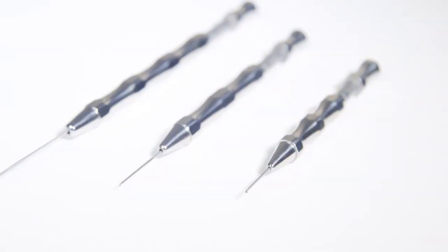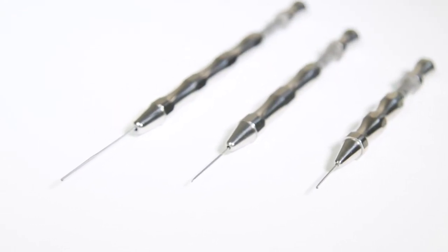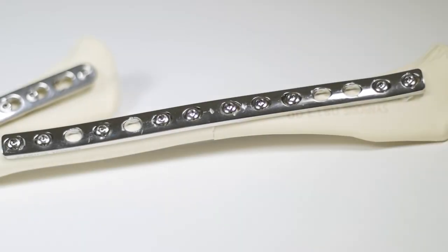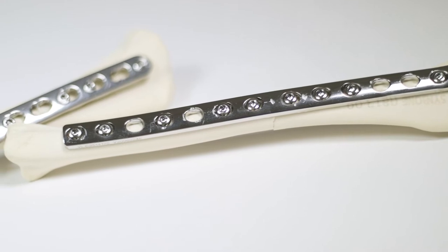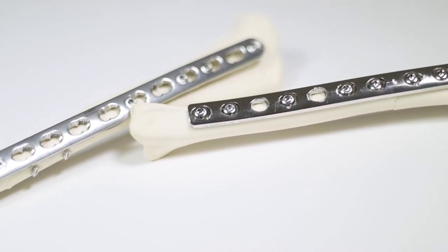A depth gauge is an essential device when performing any plating procedure, or other procedure involving placement of a screw. The surgeon must be able to accurately measure the depth of the pilot hole to choose the correct length of screw.